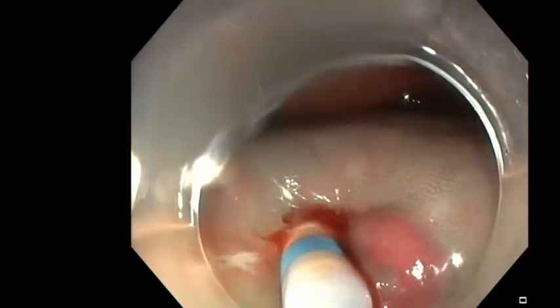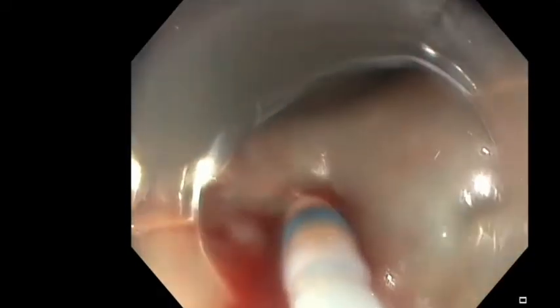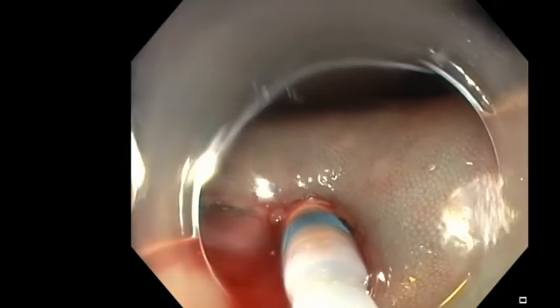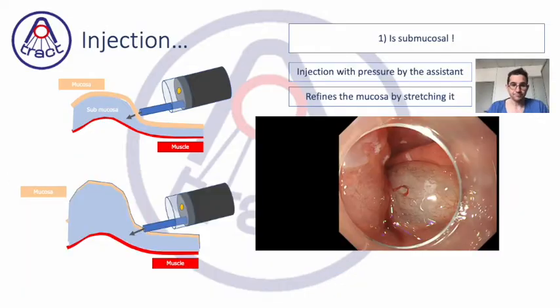And if you want to avoid any problem, you can do your incision around the hematoma, or if you have no choice, sometimes go across the hematoma to open it and try to empty it to avoid this spotting of blood every time during your procedure. It can take long minutes before the end of this small blood flow coming from the hematoma.